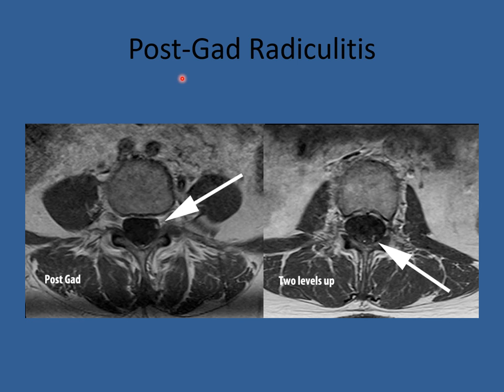There is a contrast agent we can give patients for MRI called gadolinium. Gadolinium lights things up and is useful in STIR and especially T1 images, but not in T2. This patient had continuing leg pain after recovering from a disc herniation. On T1, this nerve root lights up at one level, and going two levels up the same nerve root is lit up as it exits through the side. This is a radiculitis — an inflammation of the nerve root — versus a radiculopathy, which is compression of the nerve root.